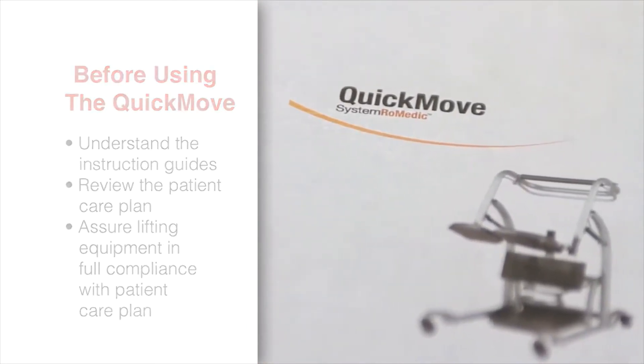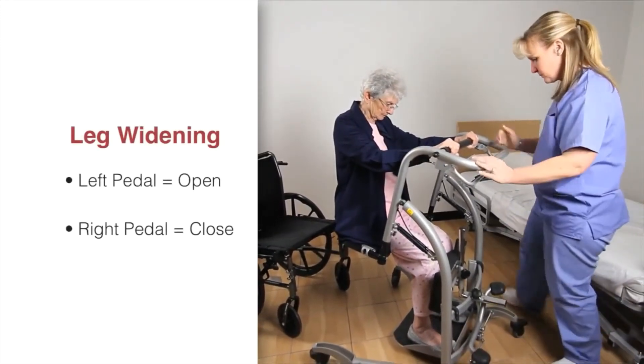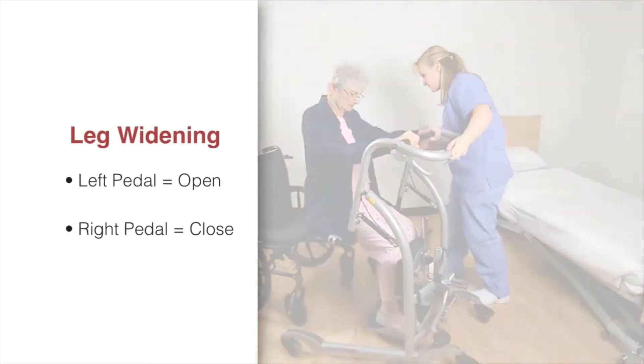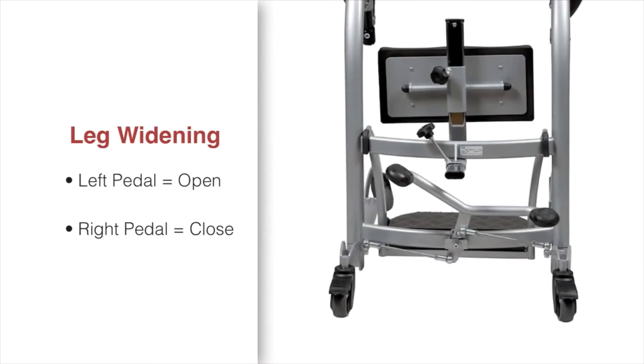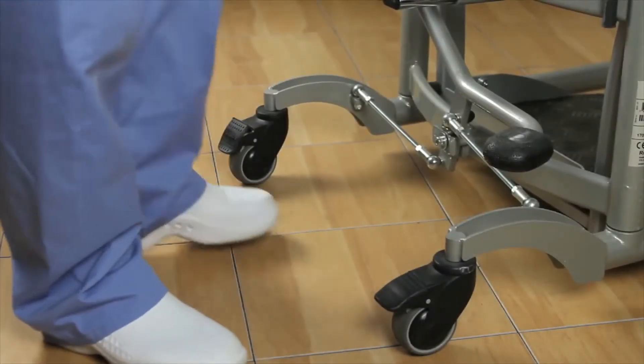The Quick Move has a manually operated leg widening function which accommodates many different chair widths. Standing behind the Quick Move, use the footplate pedal to open the legs by pressing on the left pedal and close them by pressing on the right pedal.